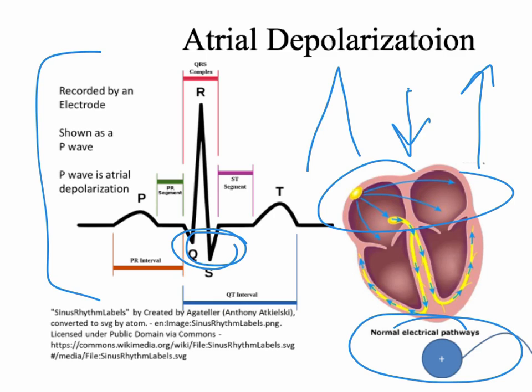As the atrium depolarizes, it creates this little peak on the EKG strip called the P wave. And because I guess the electrophysiologists like the alphabet really quite a bit, they just named each different deflection by a different letter.